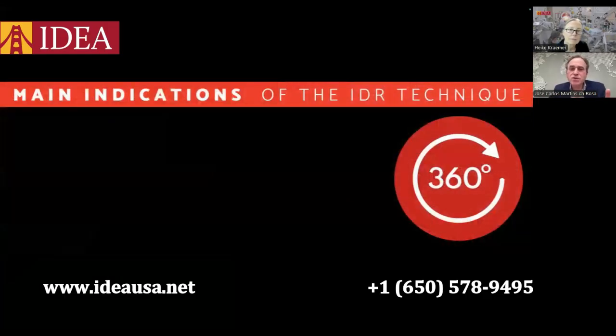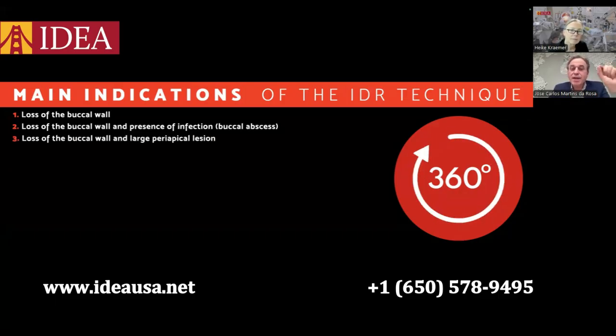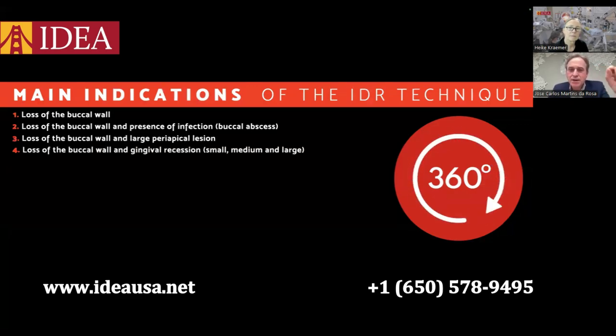We are going to focus on the main indications of the IDR technique. How to manage those cases that have loss of the buccal bone wall, loss of the buccal wall in the presence of infection, loss of the buccal wall in large periapical lesion, loss of the buccal wall in gingival recession, small, medium, and large. I'm going to share with you the treatment in detail for all these very challenging scenarios. Loss of the buccal wall, gingival recession, and loss of the papilla.